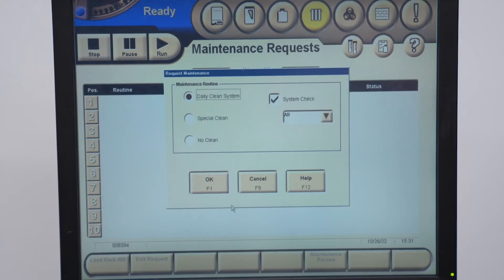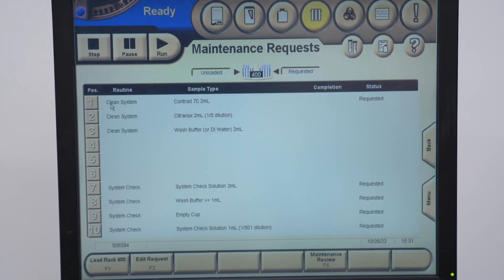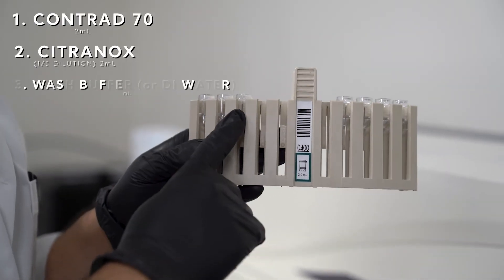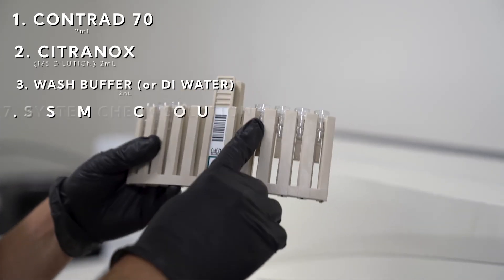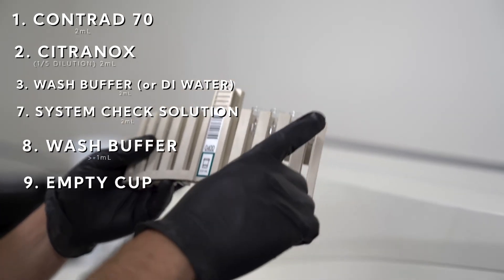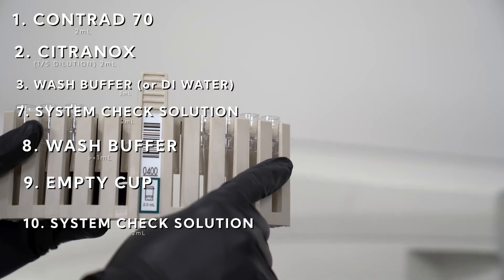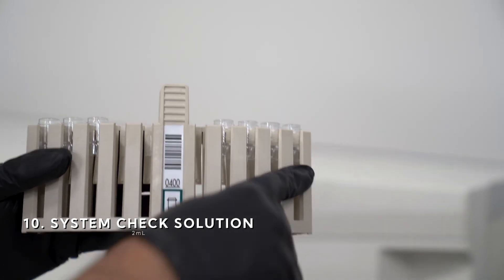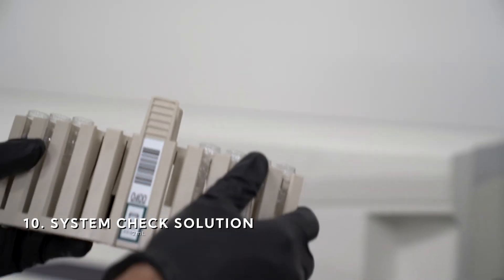So now we're ready. You have all these positions here — I've already put all the cups in. This is Contrad, this is Citroenox, this is wash buffer, this is your system check solution, this is your wash buffer, this is an empty cup, and this is your system check solution — it's one part system check solution to 500 parts wash buffer, so it's a very diluted solution.